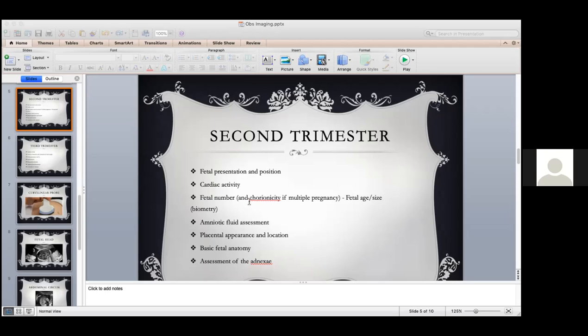So we've said you can assess the fetal kidneys, assess the bladder, assess the abdominal structures. Are they intra-abdominal? And then whether those structures are present, such as the kidneys. And then we also look at something we call the double bubble. Make sure you don't have the double bubble sign, whereby you are having a distended duodenum and a distended stomach because of a duodenal stenosis. Okay, so it gives you the double bubble sign. So you want to rule out that you're not having any stenosis in the GI.